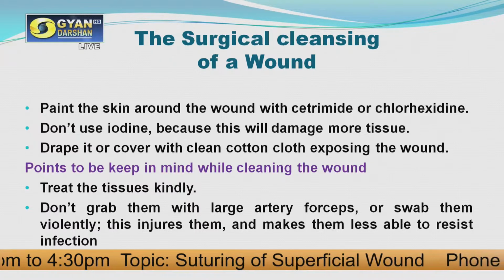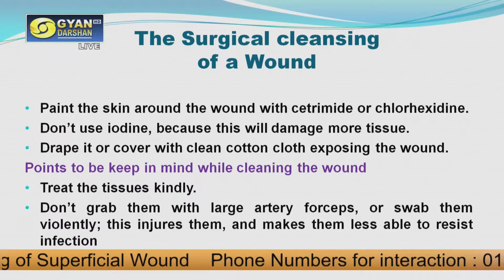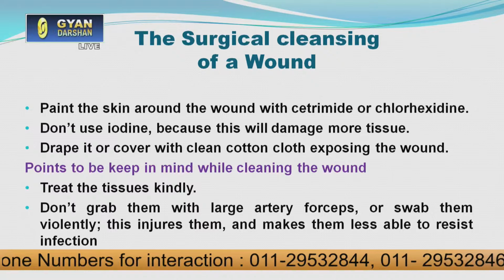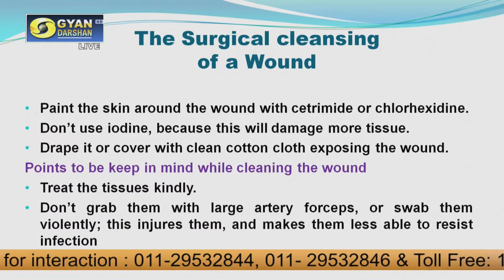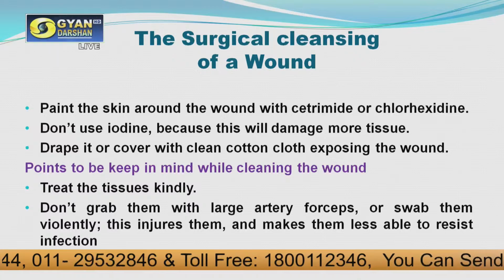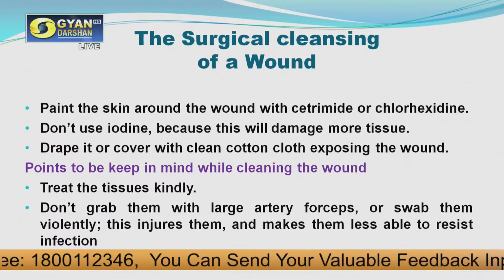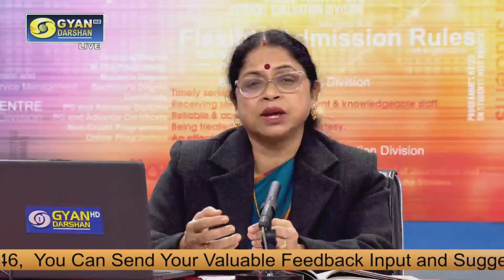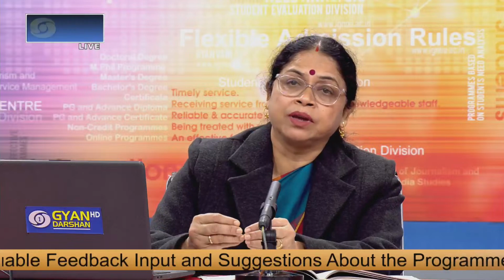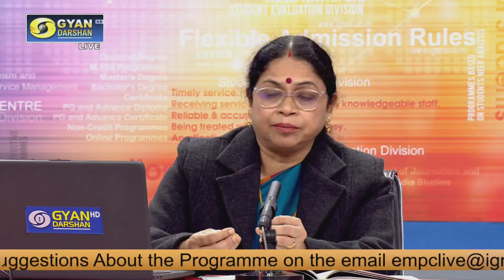Do not swab violently. If you swab forcefully, you will give more damage to the patient. This gives more injury and makes them less able to resist infection. Not only that, you are damaging the tissue, and at the same time you are giving more infection to the patient by handling the wound violently instead of gently.